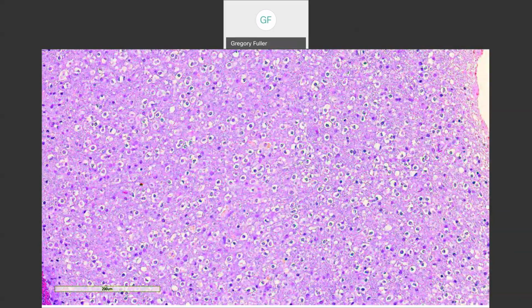It doesn't have to be curvilinear, or if the microcalcifications in the cortical ribbon coalesce, it can actually be gyriform, actually following the paths of the gyruses when it's severe, or it can simply be chunky calcification. Astrocytomas, diffuse astros, absolutely can calcify. It's not pathognomonic, but it is highly suggestive. It says put oligo at the top of your differential diagnosis.